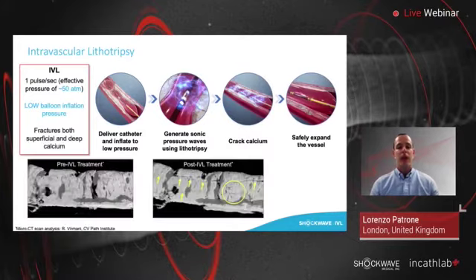Of course, this is the main picture of my presentation: the treatment of a cadaver specimen before and after lithotripsy. You can see it's very easy to see the calcium on the surface of the vessel, and post IVL treatment, you can see all the cracks.